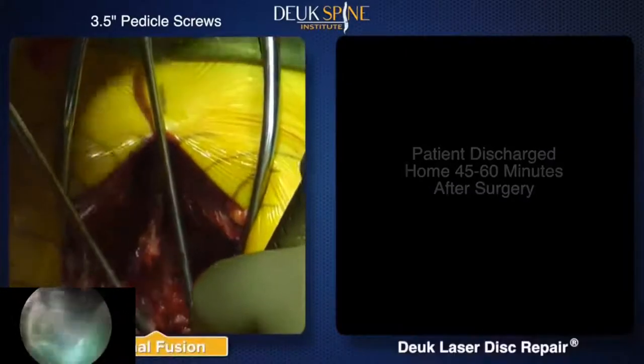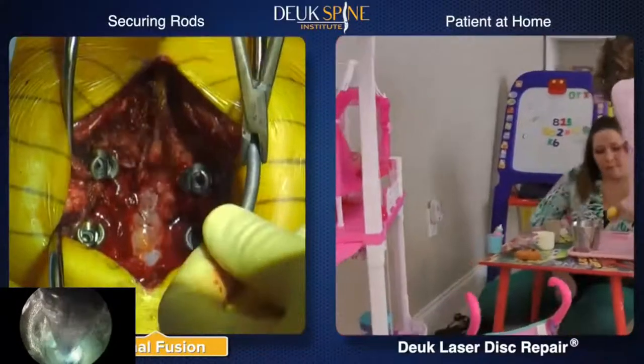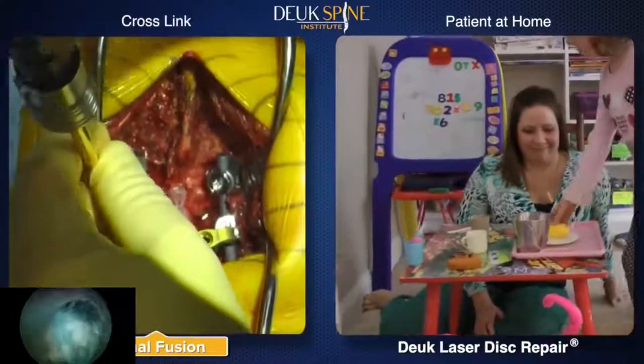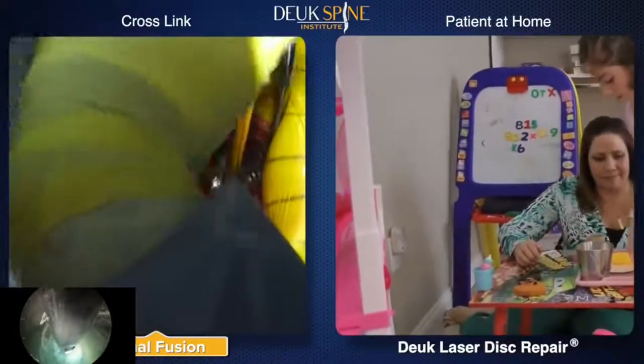The fusion screws are inserted into the bone, as shown in the X-ray. After all screws are in place, rods are used to connect the screws together to prevent movement of the secured vertebrae. Cross links are added to bridge the rods together for additional stability.